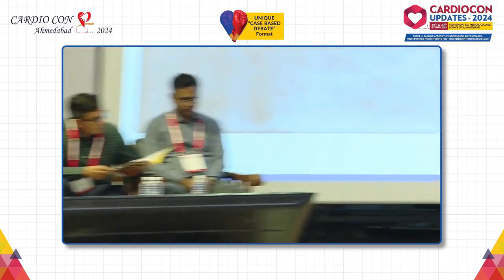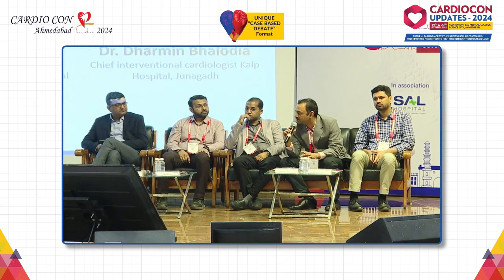Yeah. See, in crossover stenting, there is controversy whether final kissing is required or not. So there are FFR guided studies that if FFR of circ is normal, you don't do anything to circ. Don't give the balloon injury. However, the opposite view is that you should expand the stent struts and at least open it so that there are no stents overhanging in the circumflex.